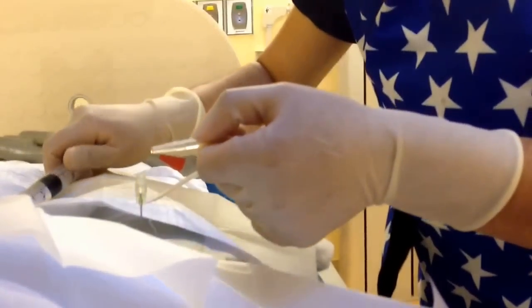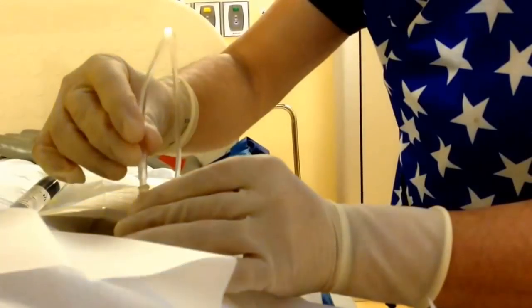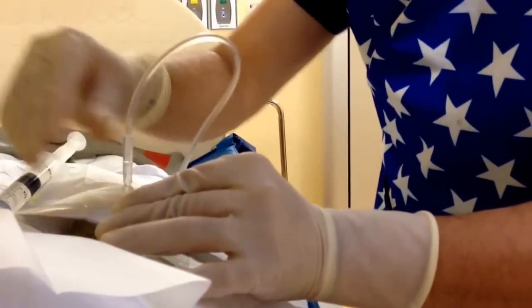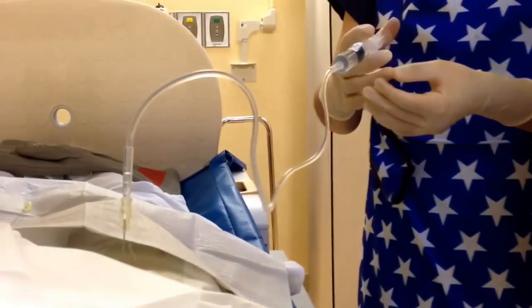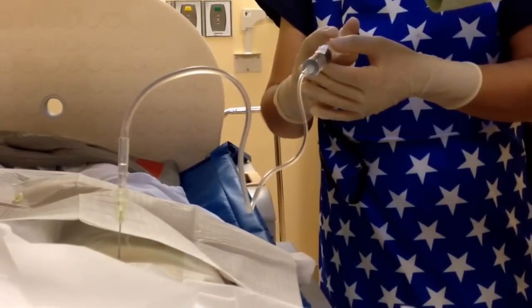The patient is focusing on relaxing. Attaching the tube again. Is this a video you're taking? Yes. I'm narrating. Taking an x-ray — make sure everything's in the right spot.